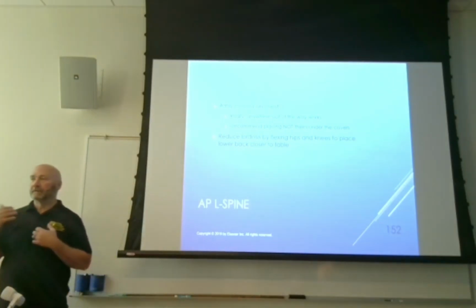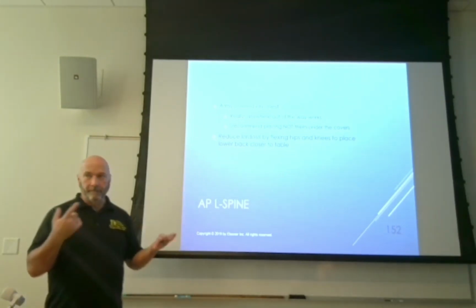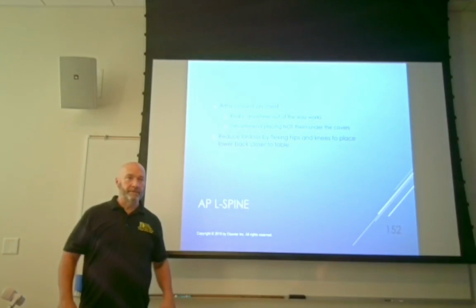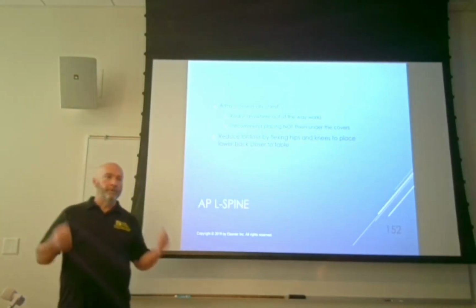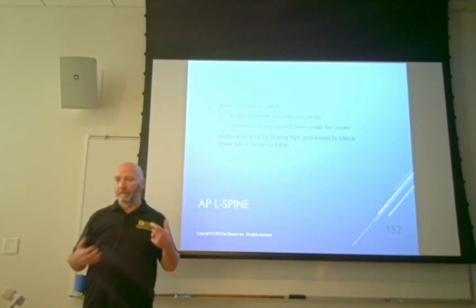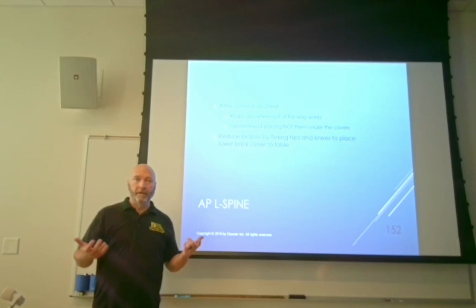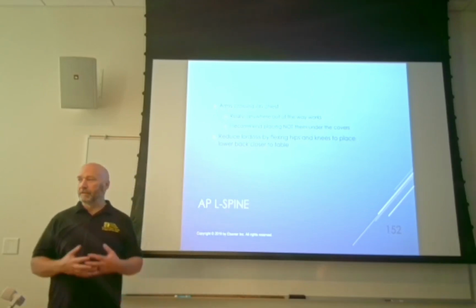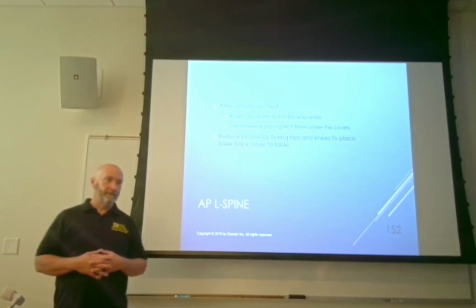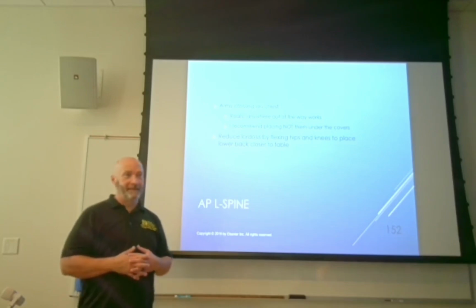This and KUB have the same problem. You get the patient all positioned and they're cold because it's cold in the hospital. You put a blanket or a sheet over them to maintain their dignity and maybe keep them a little bit warmer. And you put the sheet over their arms and you go back to making the exposure, and then you come back and you've got not only a KUB, I've seen some nods like this has happened. You've seen it? Yeah.